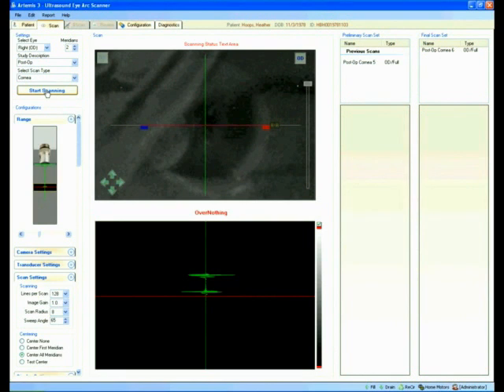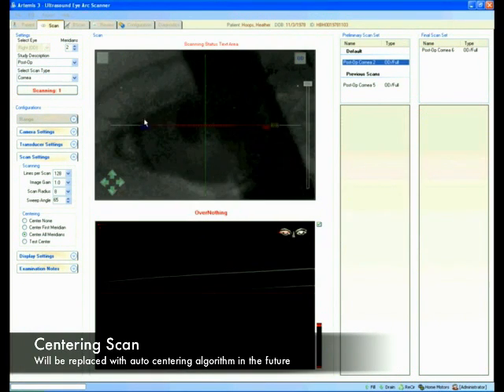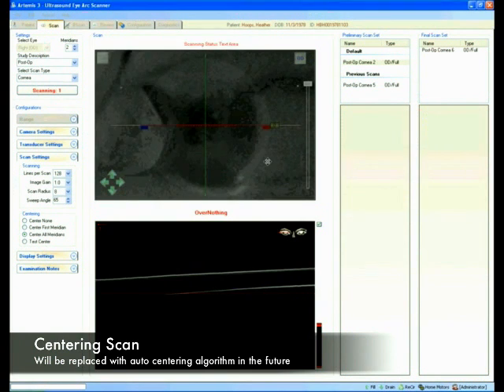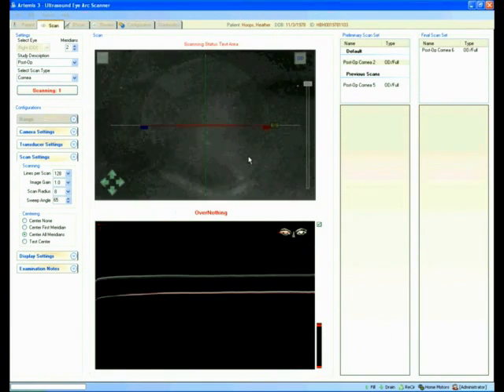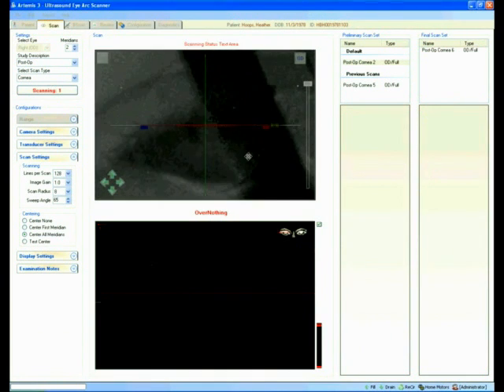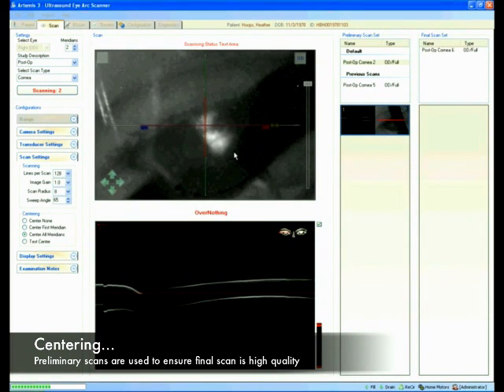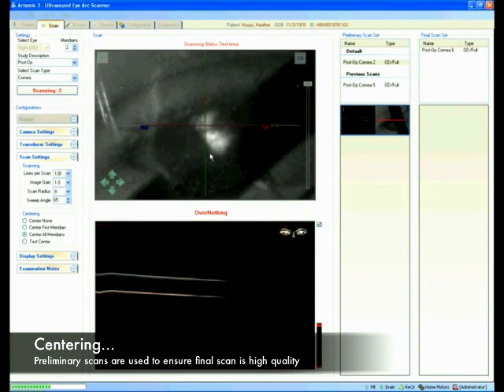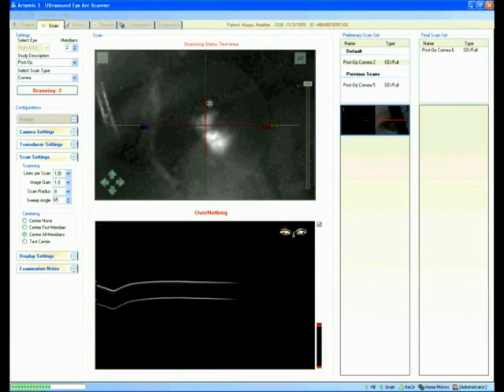At this point, I'm going to do a centering scan. Now we're centering, and it's an easy centering process. I move the transducer left and right until the scan is perfectly flat. That looks good. So now I'm going to rotate it and do another centering scan on the vertical meridian. That makes sure that I'm centered in both directions.